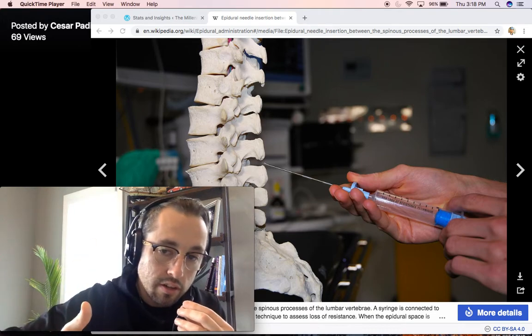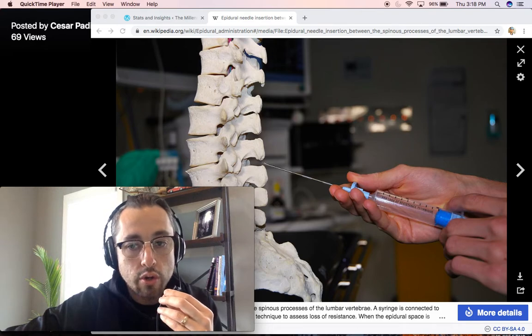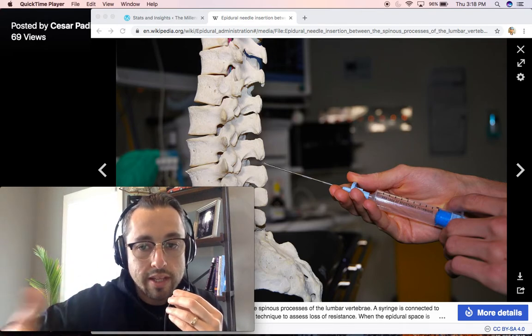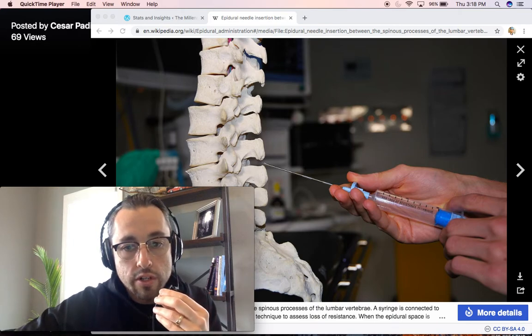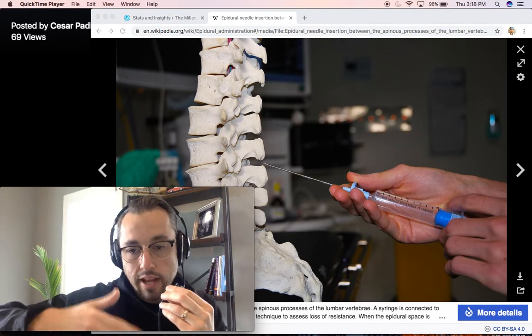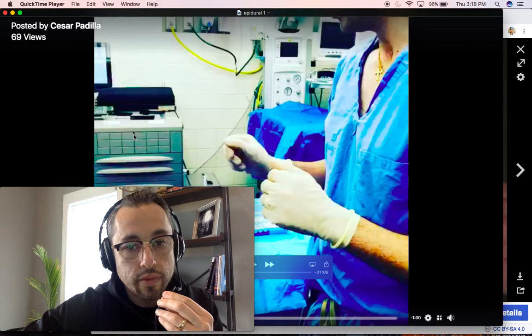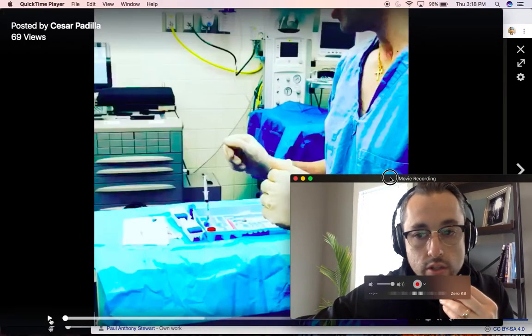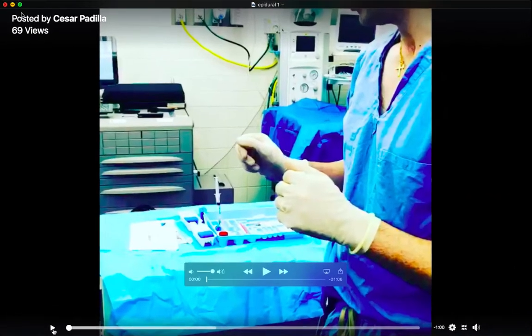So here I have a video and a step by step on how we place epidurals and what it looks like. The first thing we're going to do is I'm just going to play the video, and then I'm going to talk about it after, and take you through the steps. All right, so here we go. It's a two-part video. It's about a minute total, but here's the first part.